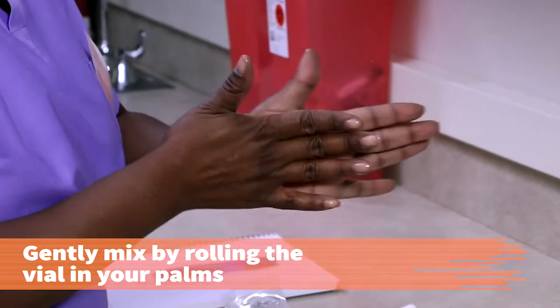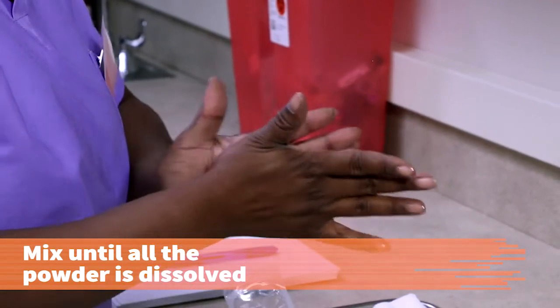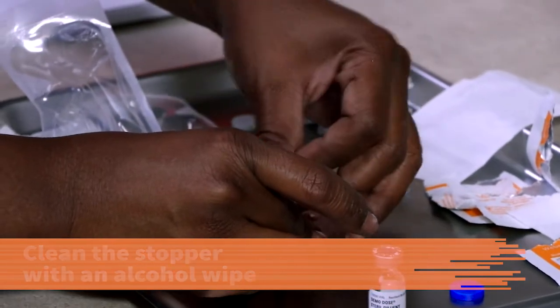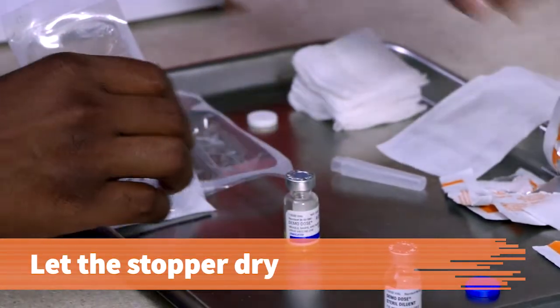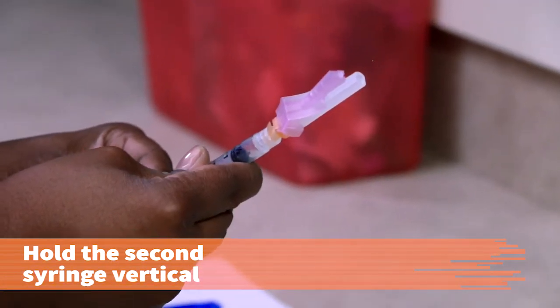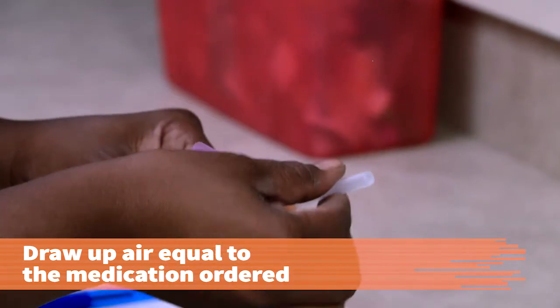Gently mix the vial by rolling it between your palms. Mix the medication until all the powder is dissolved. Clean the rubber stopper of the powdered medication vial with an alcohol wipe. Let the stopper dry. With the second syringe in a vertical position, pull the syringe plunger down. Draw up an amount of air equal to the amount of medication ordered.